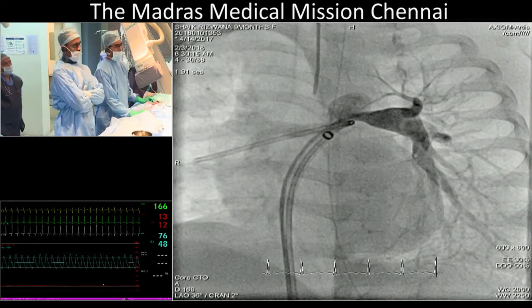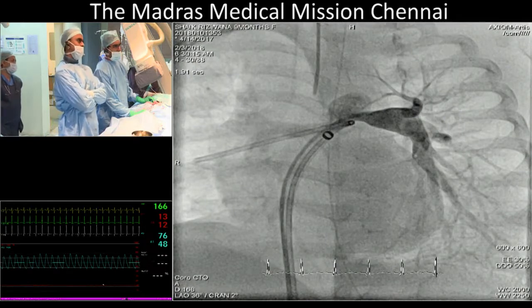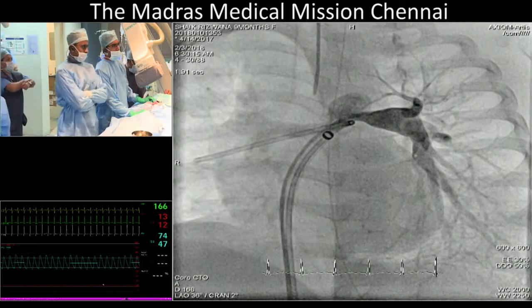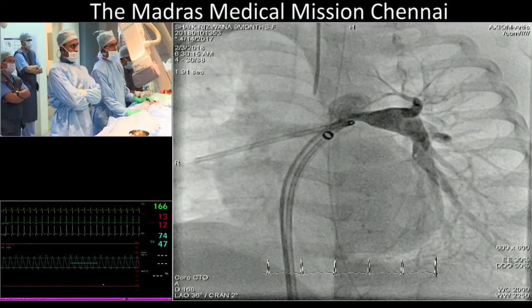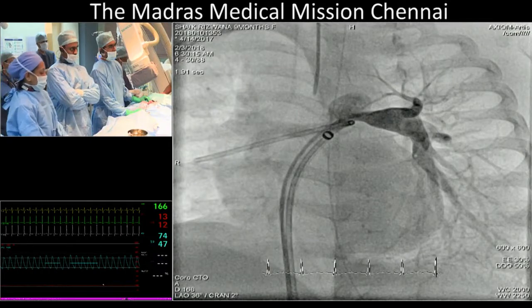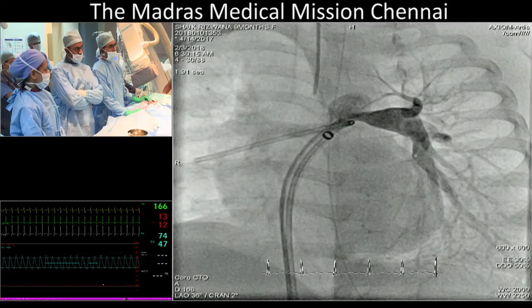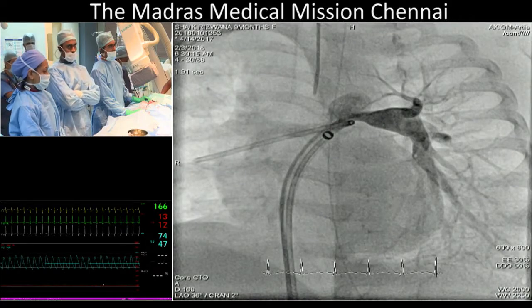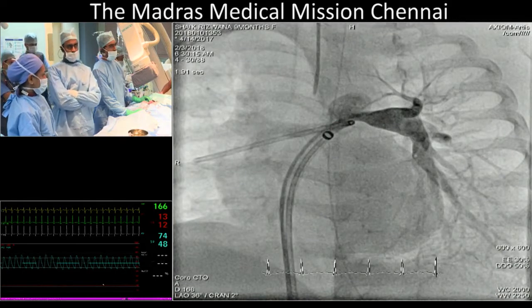For example, the difference between the left and the right. The left stenosis has a post-stenotic dilatation. I love it to see. So you have a good impact to improve by ballooning only, maybe this part. The right side is a dysplasia of the complete right pulmonary artery.